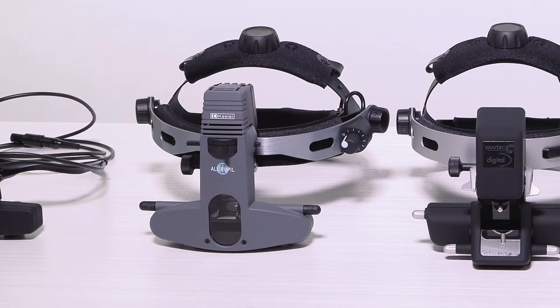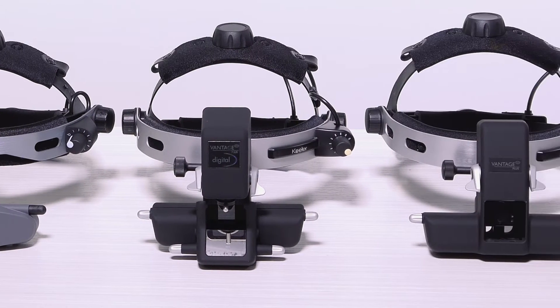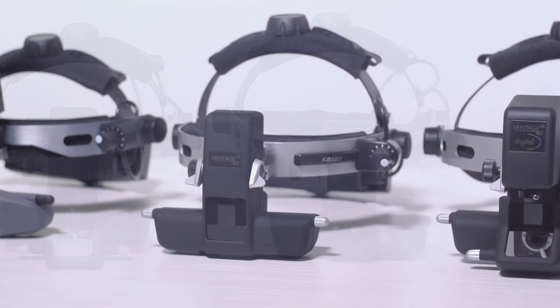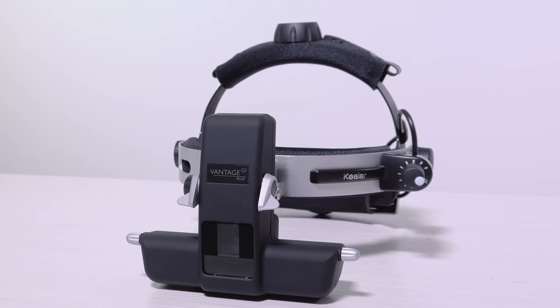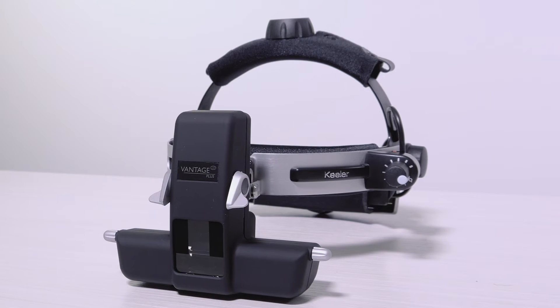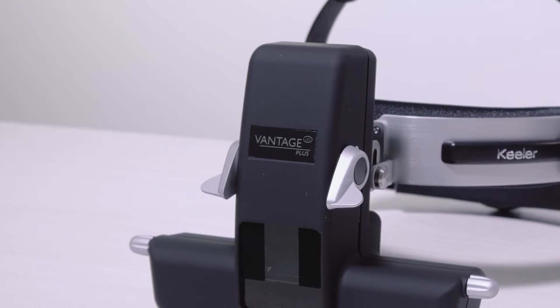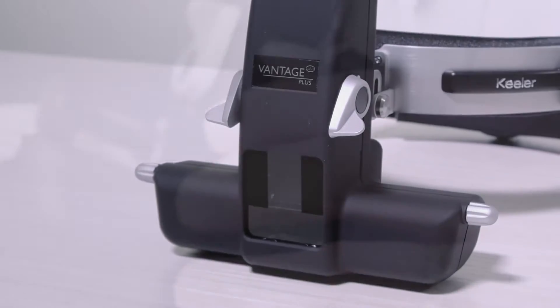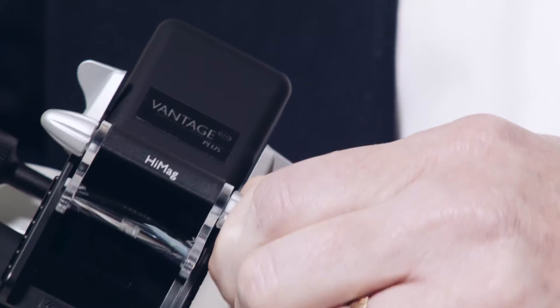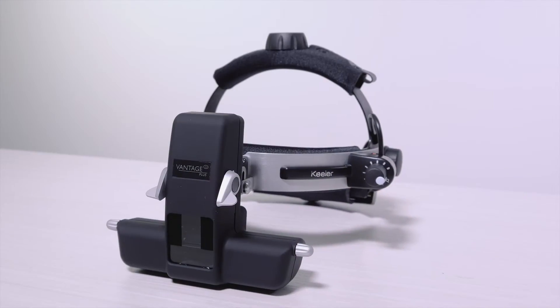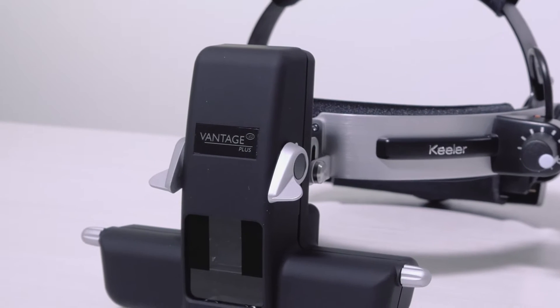The Keeler Binocular Indirect Ophthalmoscope line is known for comfort, reliability, and world-renowned Keeler optics. The Vantage Plus is Keeler's most advanced and lightweight BIO with intelligent optics, incorporating LED technology in wireless or wired formats. The patented HiMag lens provides 60% more magnification when in place. This video will provide an overview of the Vantage Plus features and a guide on how to use it.